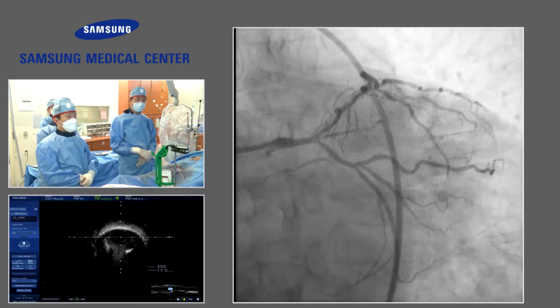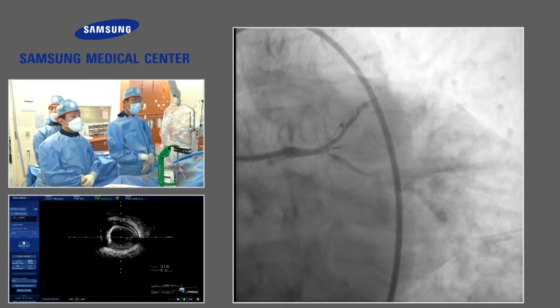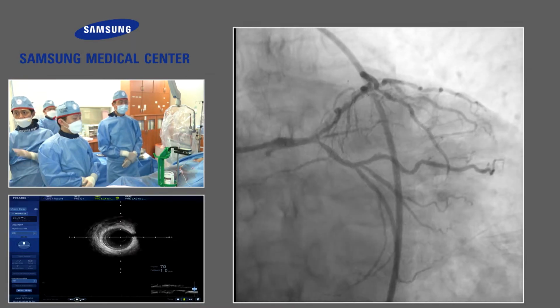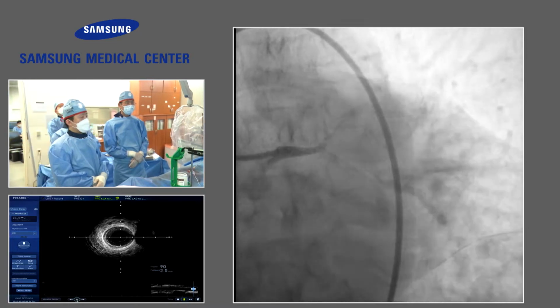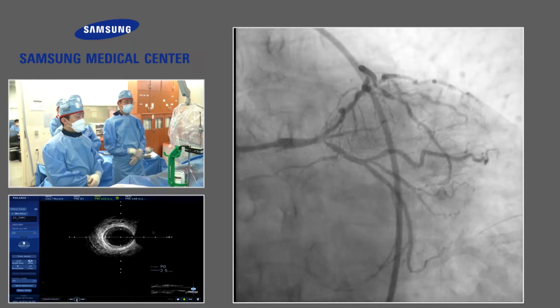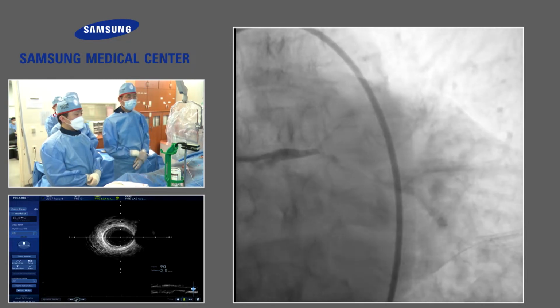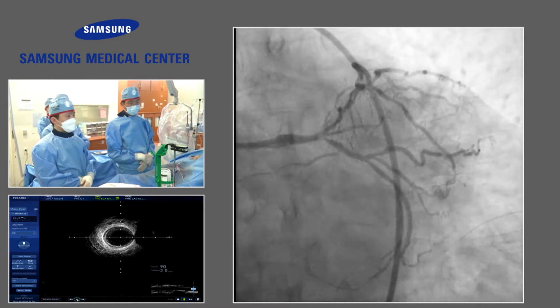And then the angiographic appearance. The calcification looks very heavy, but the IVUS image does not show so much. That is another message. And in the angiographic appearance of the mid to distal LAD, there is some narrowing, but the IVUS finding is that lumen area is more than 3.0, so your treatment strategy was changed a little. Right. So I will show the IVUS from the circumflex.